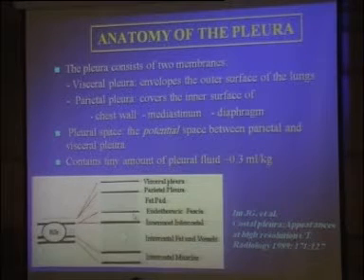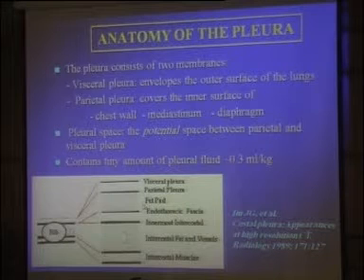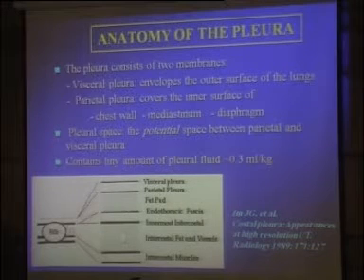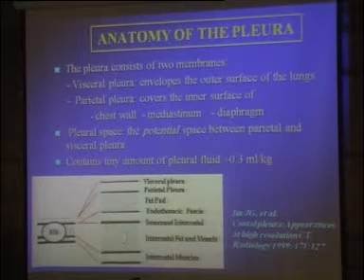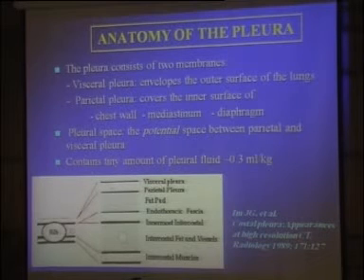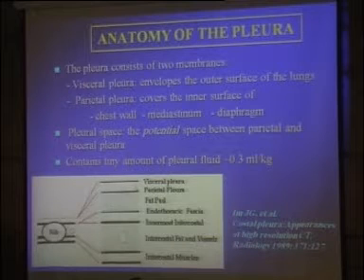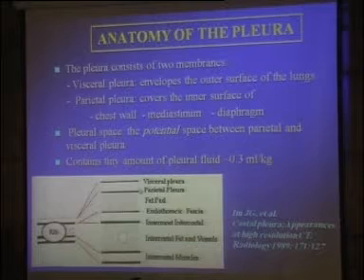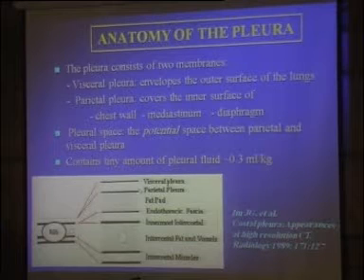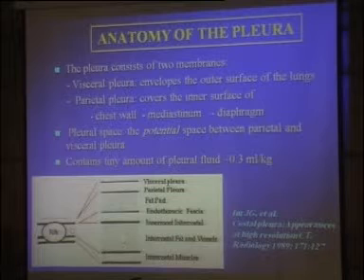And consequently, when you perform medical thoracoscopy, and for instance, if you use talc to create a symphysis in patients, of course with dedicated talc particles, the talc particles still remain at this level. And whatever happens in the future, extrapleural lobectomy, extrapleural pneumonectomy is feasible.